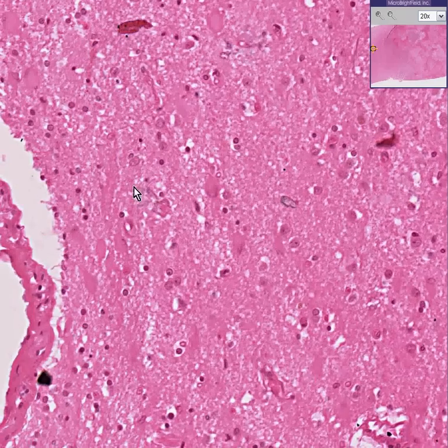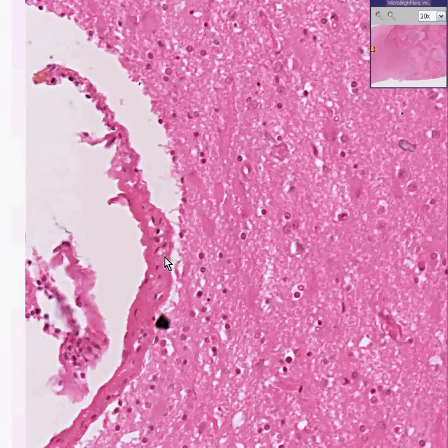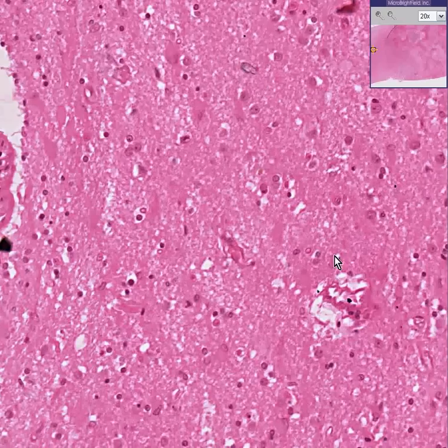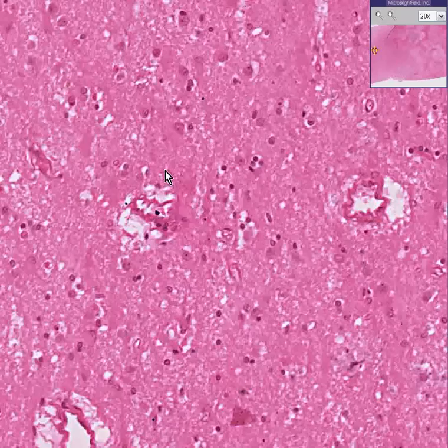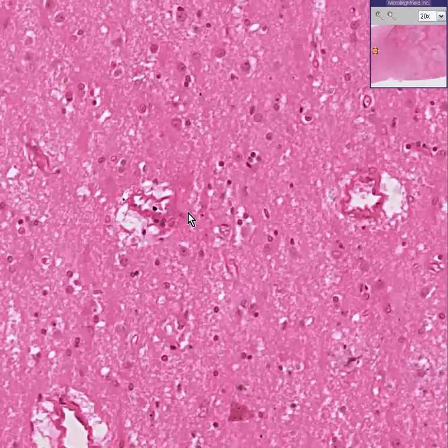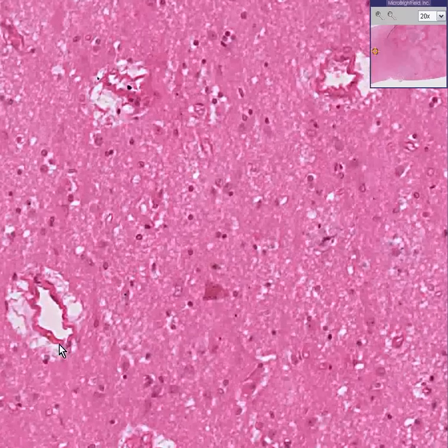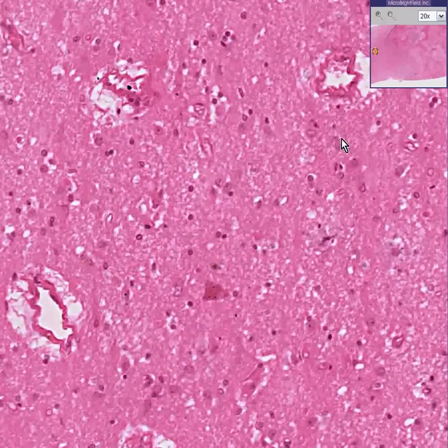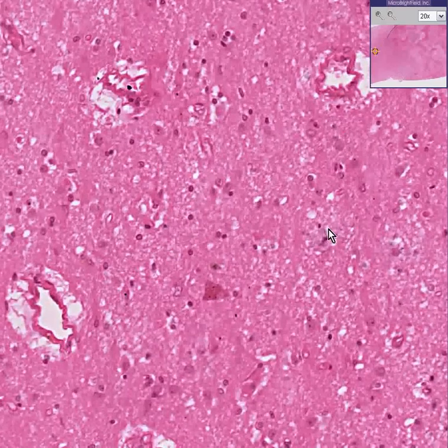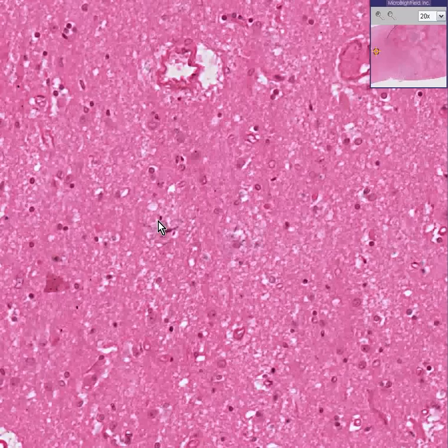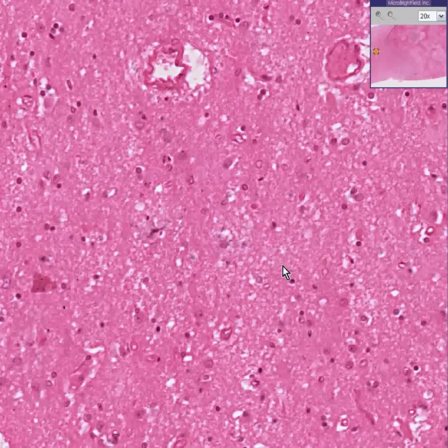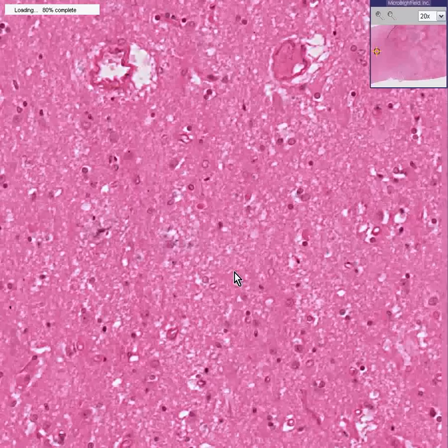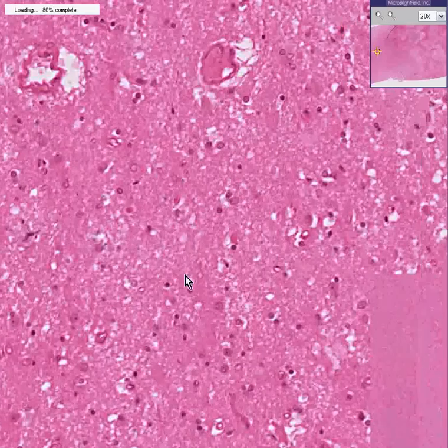Oh, there you see a blood vessel, kind of a large blood vessel within the brain. Here's a smaller one. Here's another smaller one, but most of this is normal, perhaps white matter of brain.